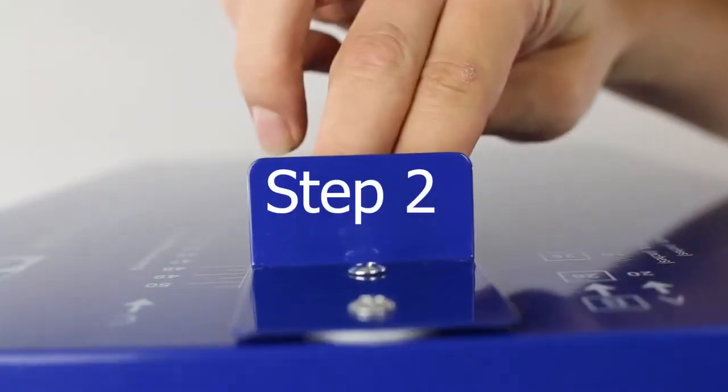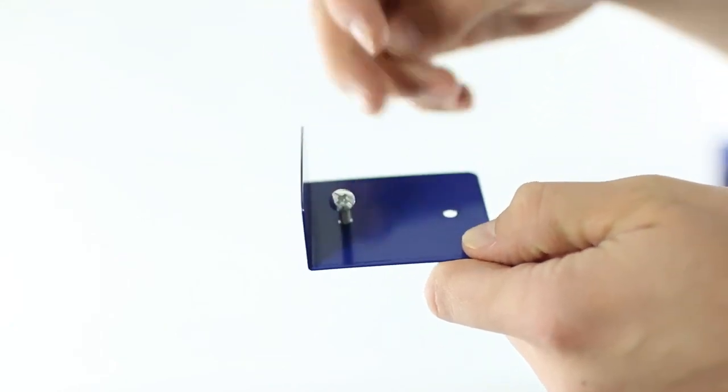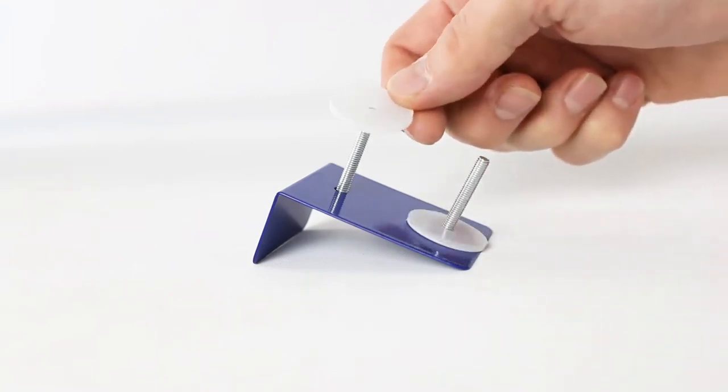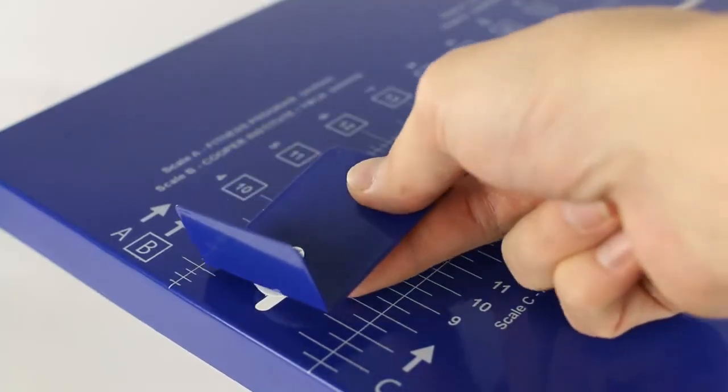Assembling the slider. Insert the channel mount screws labeled D through the holes on the finger plate labeled B and put one Teflon spacer labeled F through each screw. Place the screws into the channel on the top plate.